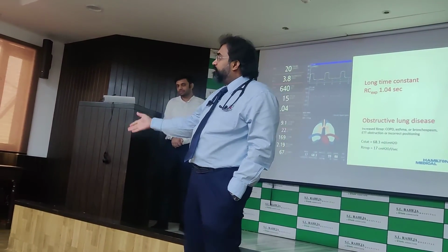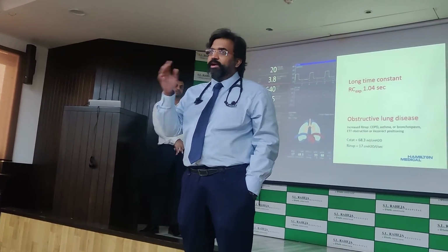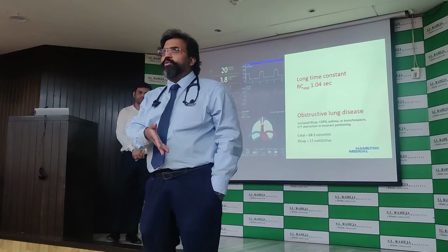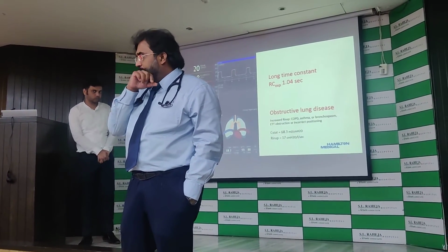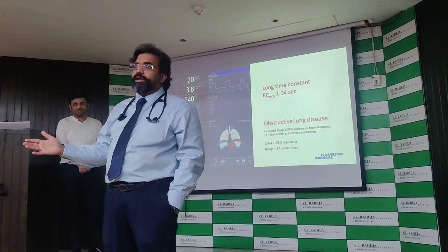That is why I don't take the plateau pressure of 30 as adequate. Take it as low as possible. So if you are seeing a 29, don't be happy. I want to get it to 25, I want to get it to 20. That is what your thinking should be. And a certain time will come when suddenly we'll say plateau pressure should be 20.